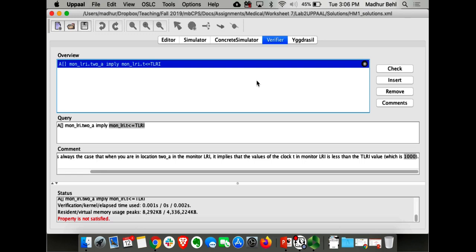So indeed, if our pacemaker is right, the same property in the presence of bradycardia this time should be satisfied for all traces. Meaning that no matter what your heart does, there is never an instance where the pacemaker is not able to maintain a V2V interval.